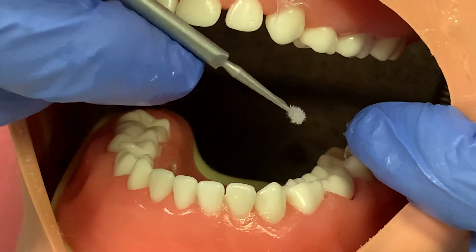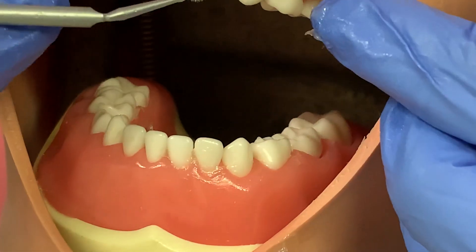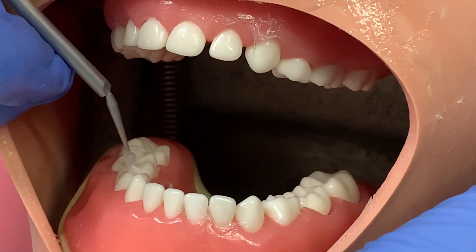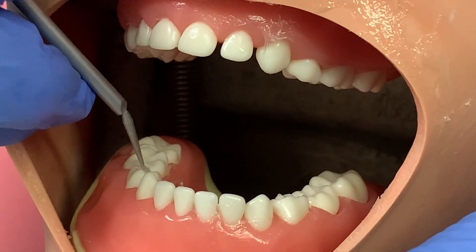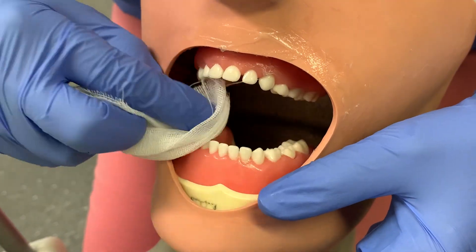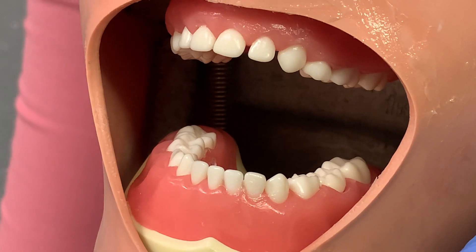Paint it into the cavities and let it soak in for up to three minutes — at least a minute. You want it to be dry and you don't want too much excess gripping onto the soft tissues. Once you're happy and you've finished, just blot it dry with either some gauze, or alternatively a fresh micro brush — if you're doing it into a cavity that might be an easier way.